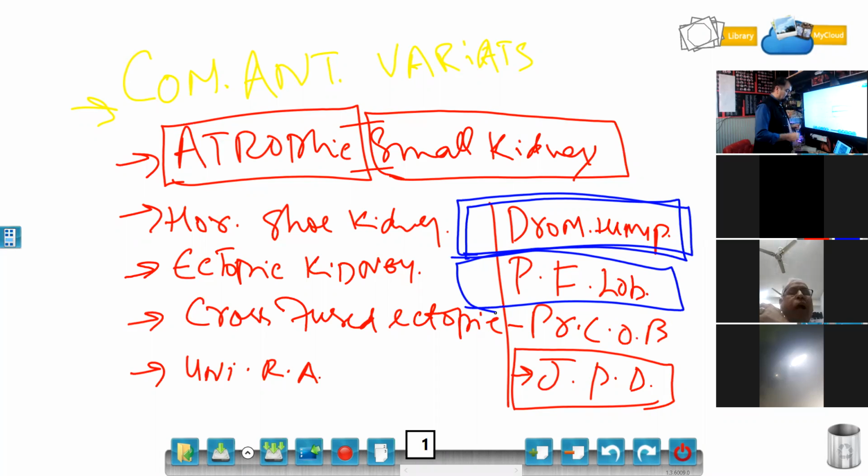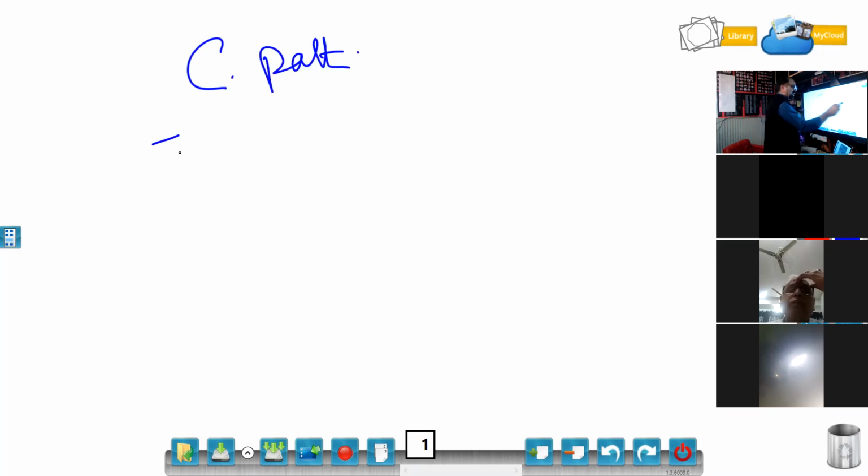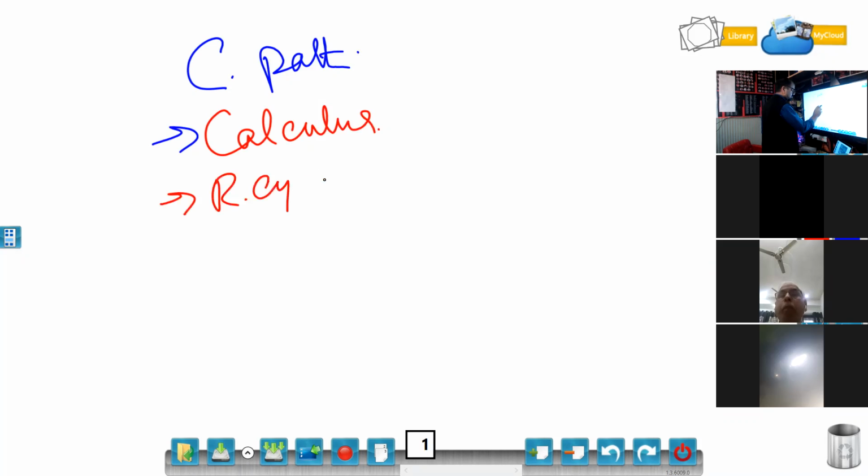Now, abnormalities, common pathologies. So these are the common abnormalities. Now the common pathologies. First of all, the favorite of all, calculus. Then renal cysts, and these can be cortical, these can be parapelvic cysts.